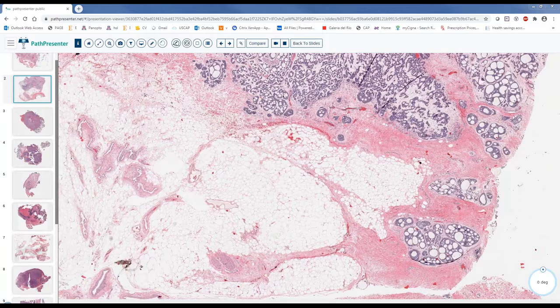And of course, basaloid with all the necrosis. First of all, they won't have that much similarity: they tend to have more necrosis and very dark cells with a very high N/C ratio. If there is no way by histologic examination to separate solid, high-grade adenoid cystic carcinoma from basaloid squamous cell carcinoma, you can first do HPV. HPV will be helpful for basaloid; it will be positive. P40 is usually positive, but it can also be positive in adenoid cystic carcinoma.